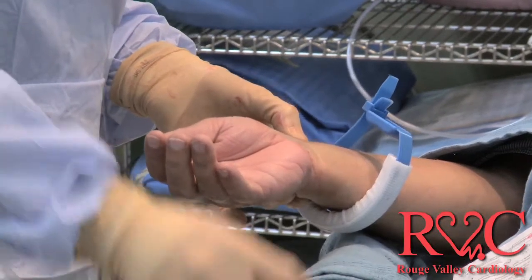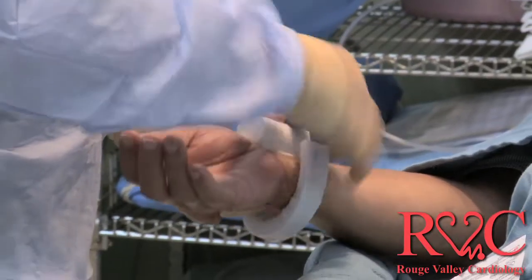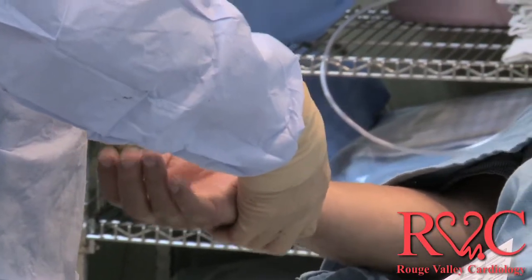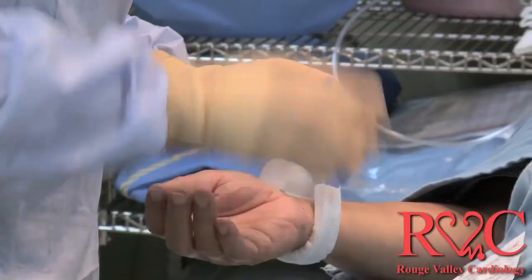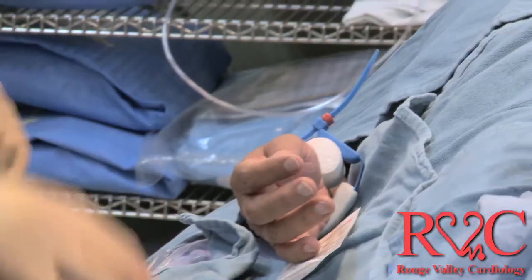After a procedure like this, particularly when it's done through a radial approach, a clamp would be put on the artery and the artery occluded for a period of 2 hours. The patient will then stay in hospital for a period of usually 12 hours overnight. Sometimes they're sent home that same day, and will be taking aspirin and Plavix for a period of 6 months to a year or two after the procedure. Usually normal activities can be resumed within a period of 24 to 48 hours, unless the patient has had a heart attack, in which case usually a period of convalescence of 2 to 4 weeks is required.